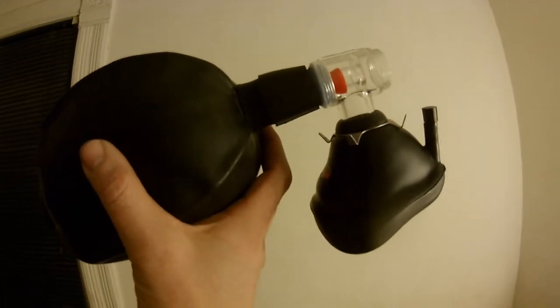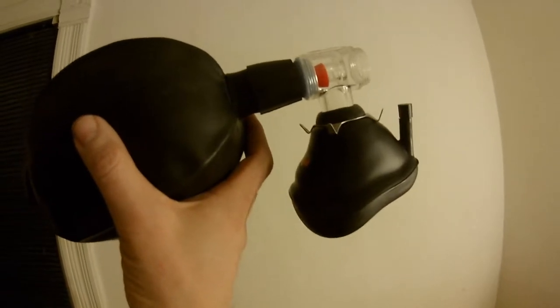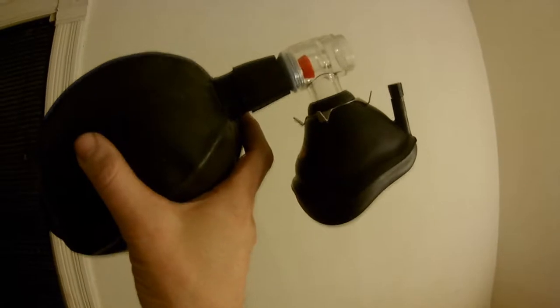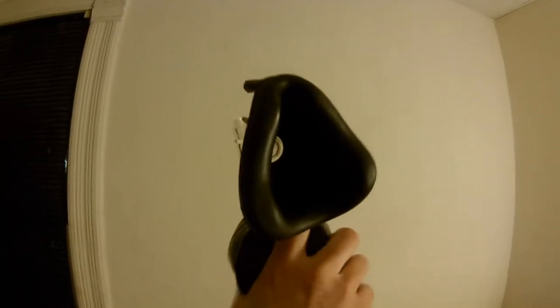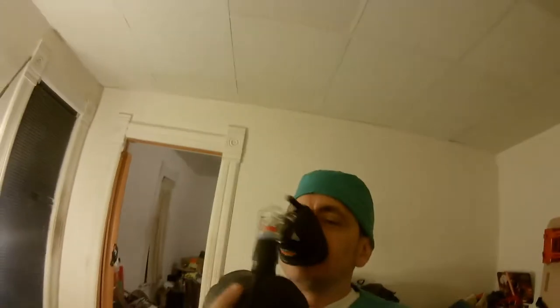The resuscitator, otherwise known as the Bag Valve Mask resuscitator or BVM, is used to force air into the lungs of an unconscious patient — or sometimes a conscious patient, which is probably not a good idea anyway. In order to administer the air into the patient's lungs, all one has to do is seal the mask against the patient's face. This particular piece of equipment requires a lot of training and practice to perform the resuscitation technique.